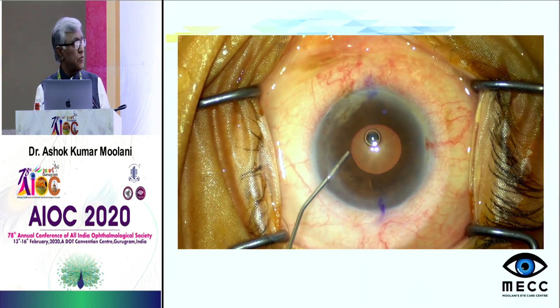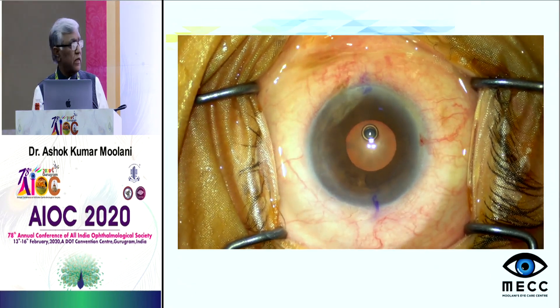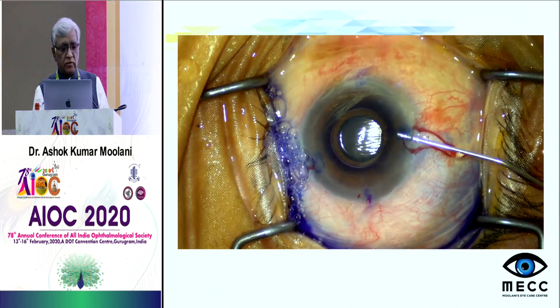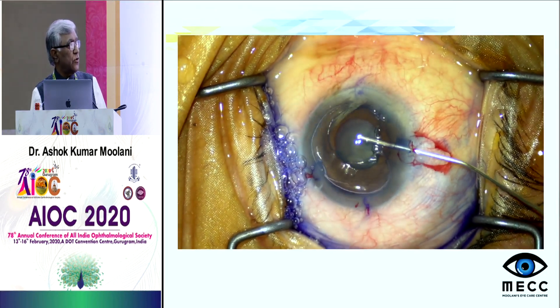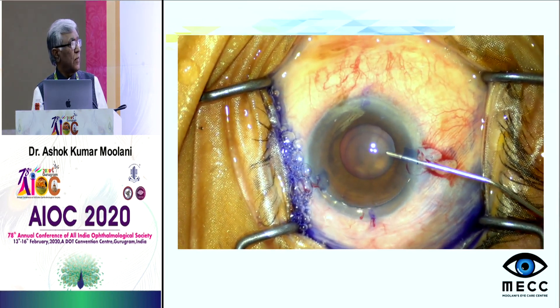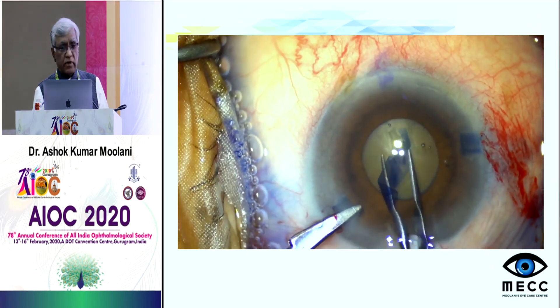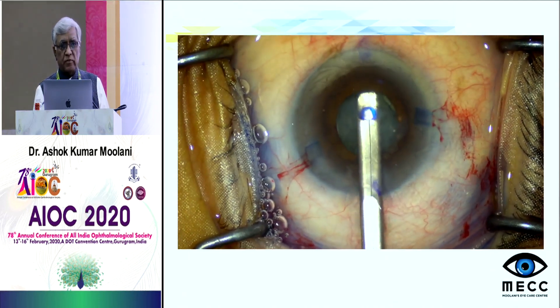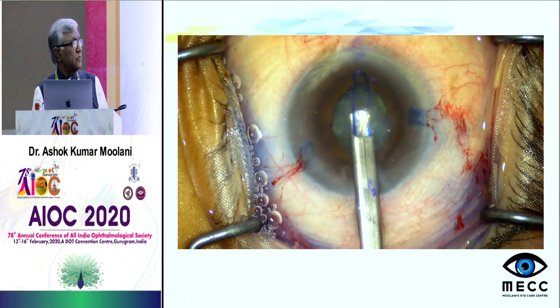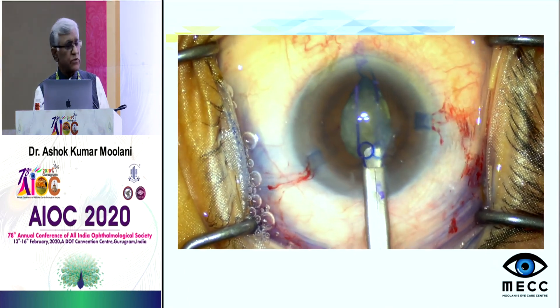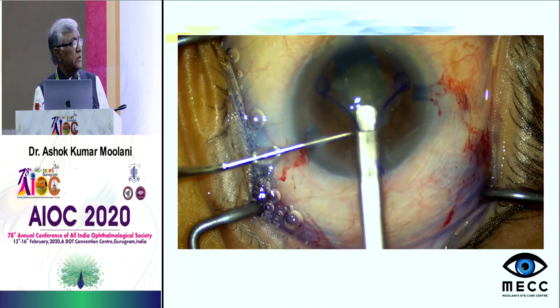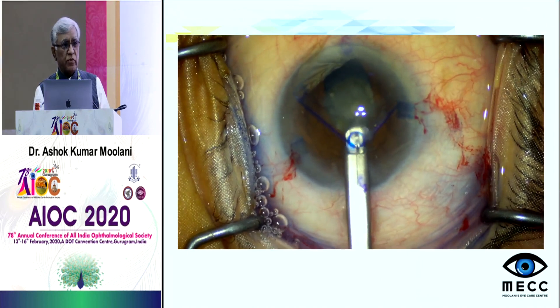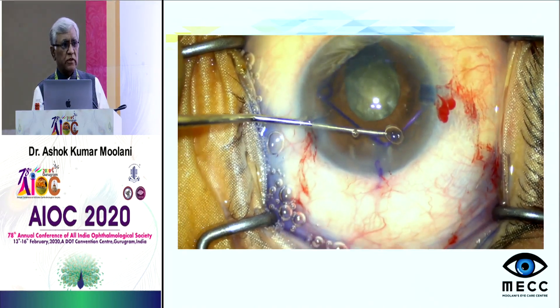Here is another case of small pupil where I tried intracameral mydriatic and viscomydriasis. I stained it with trypan blue, removed it with viscoelastic, then did capsulorhexis along the pupillary margin. In spite of that the pupil was still small, so we used a pupillary expansion ring — the Malyugin ring. Always use the distal scroll first, then put in the lateral and medial scrolls. Also put some viscoelastic between the iris and anterior capsule to create space for the ring.